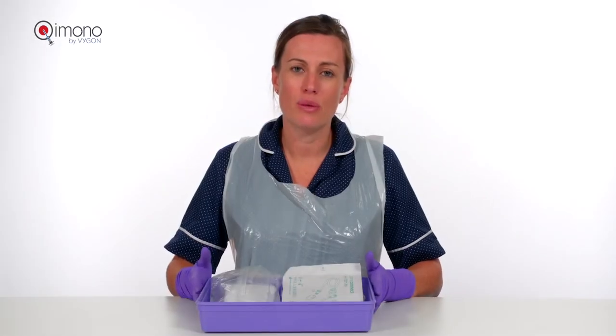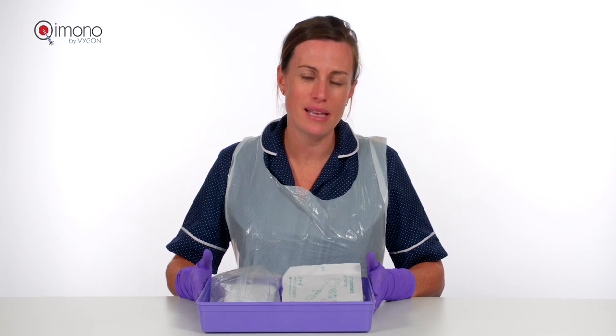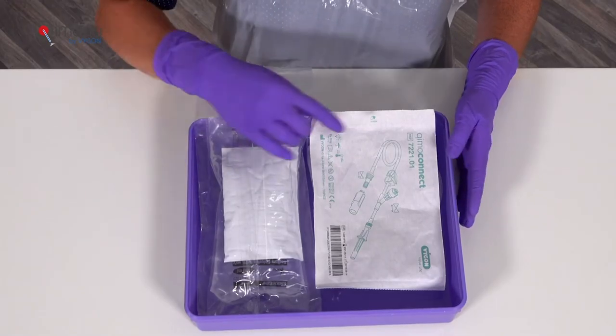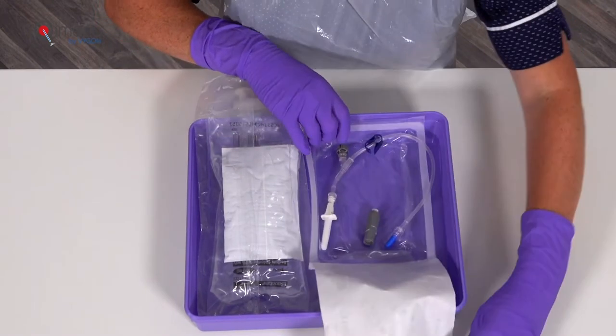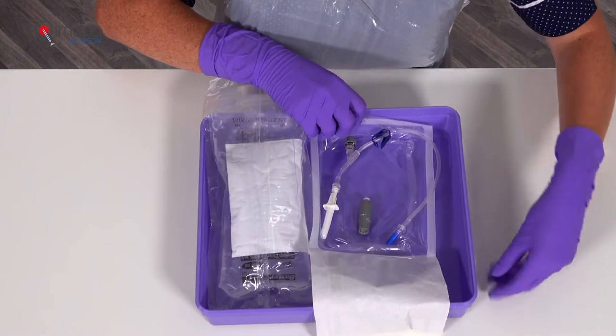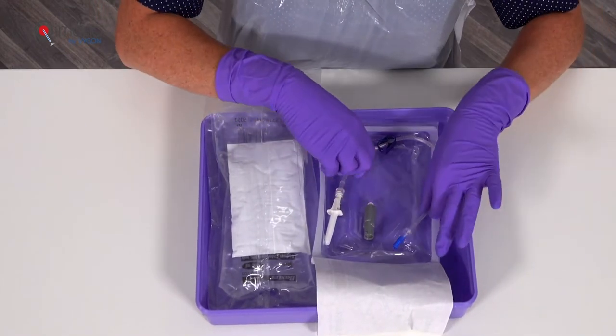This clip is with regard to spiking the systemic anti-cancer therapy bag. For this we will need the Qimoconnect. Inside the bag we have a Qimo male and the spike system.